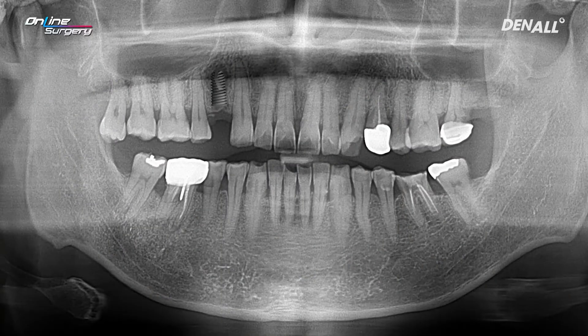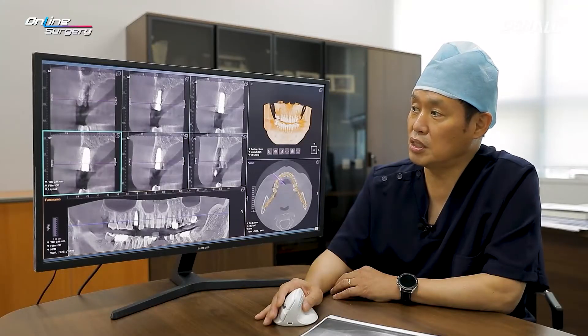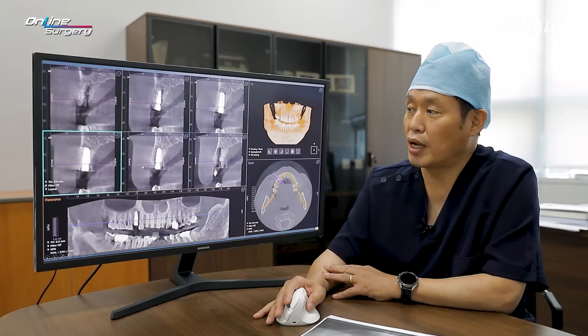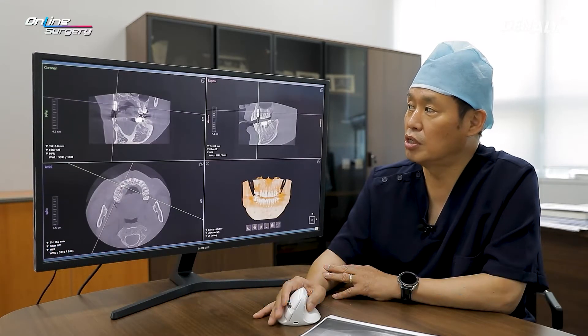This is the post-op image. The primary stability was very good and the healing abutment was connected. If you look at the CT, as mentioned earlier, the implant was slightly palatally inclined to get more primary stability from the hard bone on the palatal side. Buccally, the alveolar bone thickness is approximately 3 mm, and therefore no additional bone graft was done.